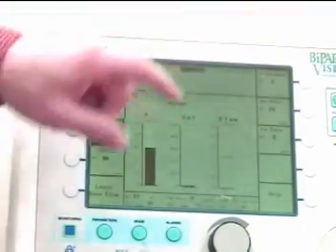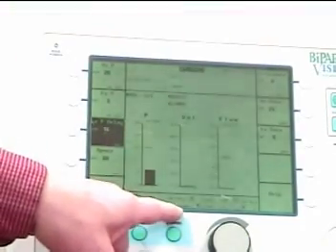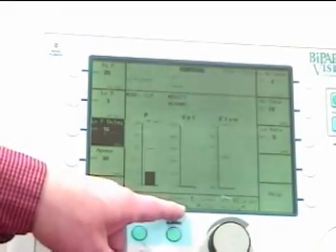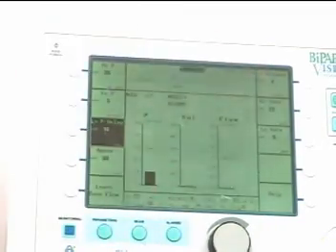Low minute volume is going to be based on what the patient is doing. So really you should go back after this is on the patient and adjust the low minute volume.